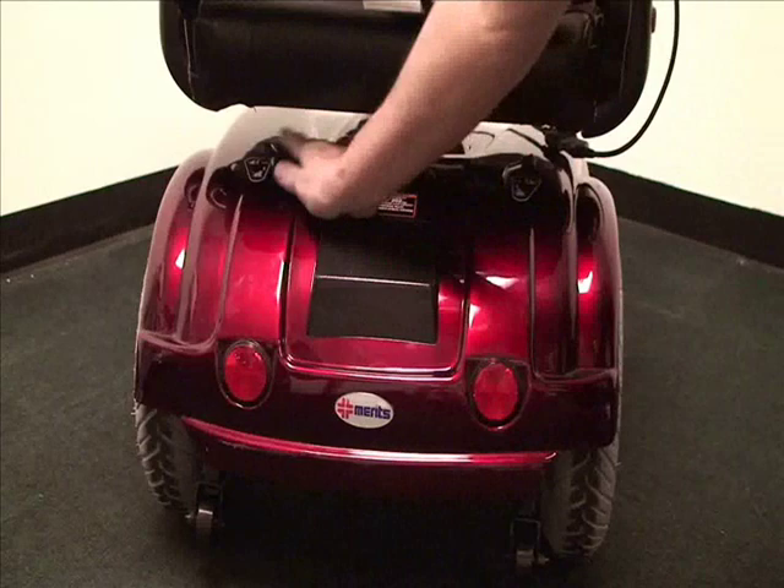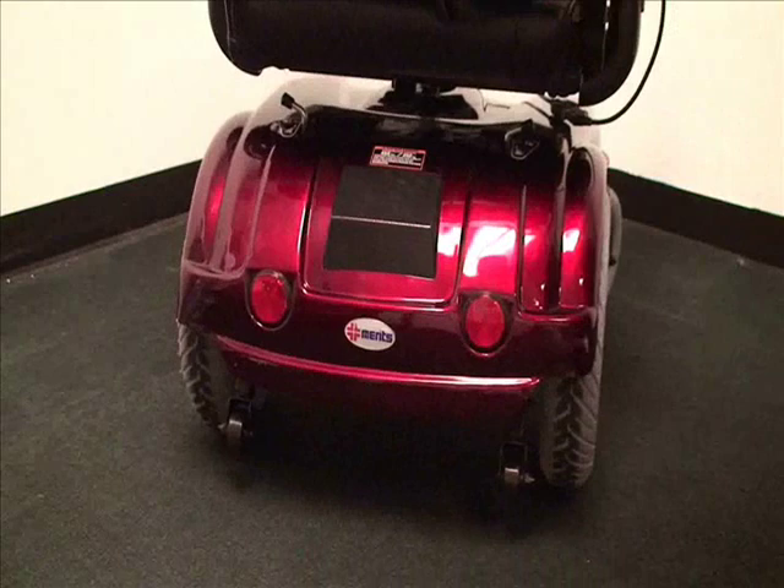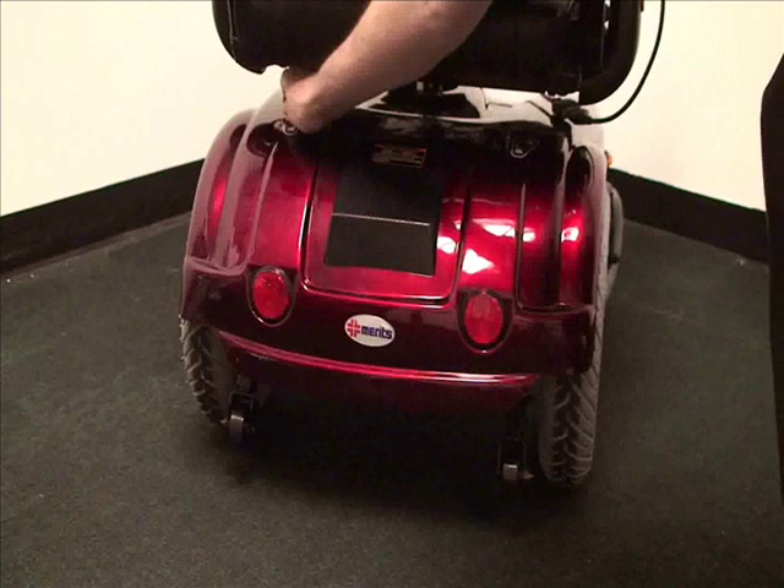To disengage the gearboxes, simply turn the levers to the side. That way the chair can be pushed easily either with the patient or just to transport the chair. Just remember to re-engage them before using the chair again.